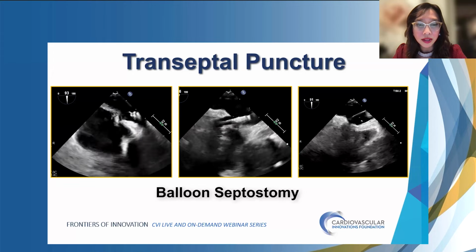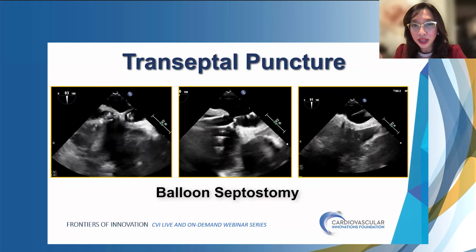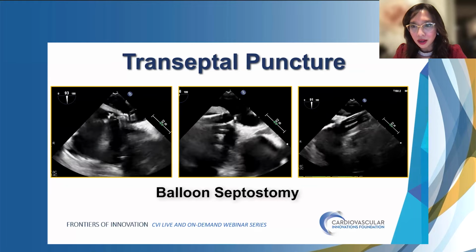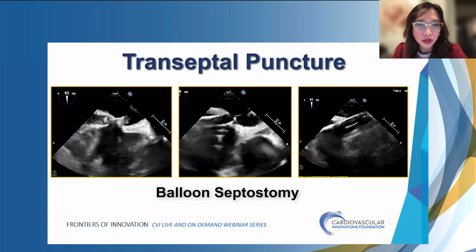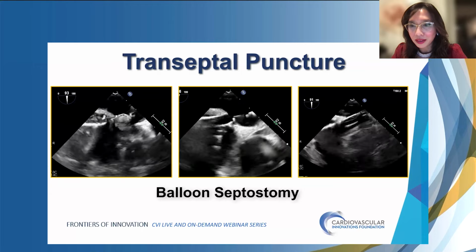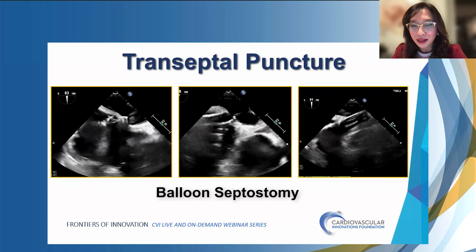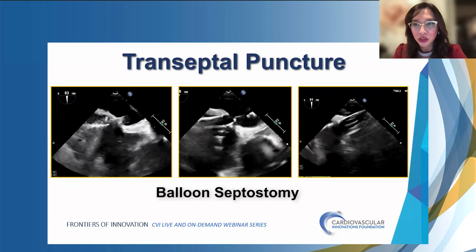you can see on the left-hand side. And then, Paul, you exchange wires and try to put the angiovac catheter, on the middle side, but there was something stuck there. And I think that's when you did a balloon assisted tracking on the right-hand side here.